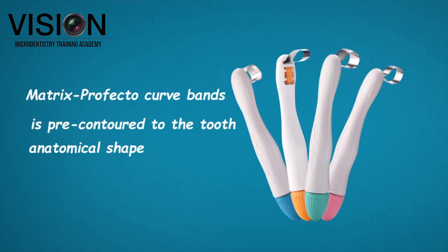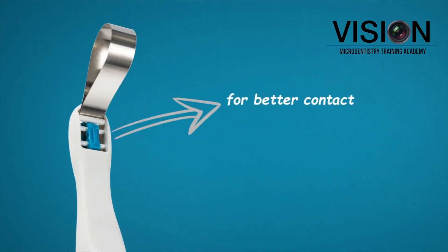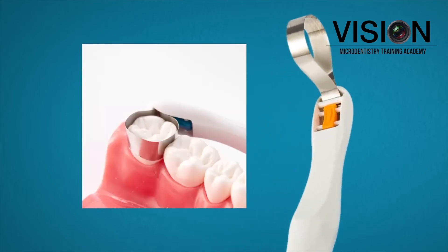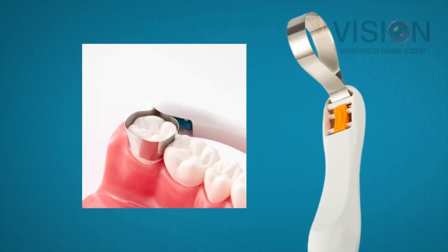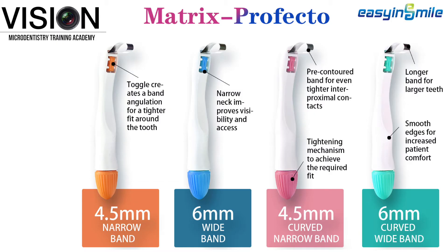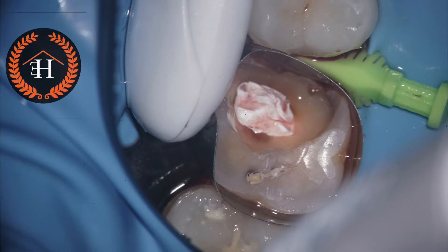It's available in four different sizes depending on whether you want a straight, pre-contoured, or pre-curved matrix band. It's very similar to our Tofflemire matrix system, but these are available in plastic and are disposable and easy to use. For this particular case, I used a 6 mm flat matrix.